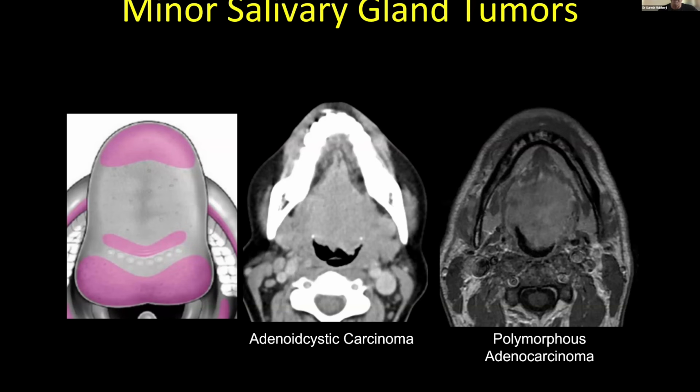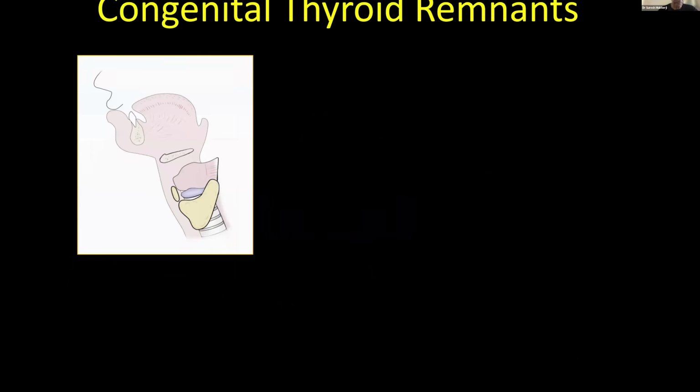And the only thing that I can use to help differentiate is that if I see a mass right here and the surgeons look down and see everything is submucosal, that is more suggestive of a minor salivary gland tumor. But as opposed to the regular imaging findings, maybe if you see something that's high signal on T2, then you can suggest maybe a pleomorphic adenoma. But in general, I find the imaging findings to be nonspecific.